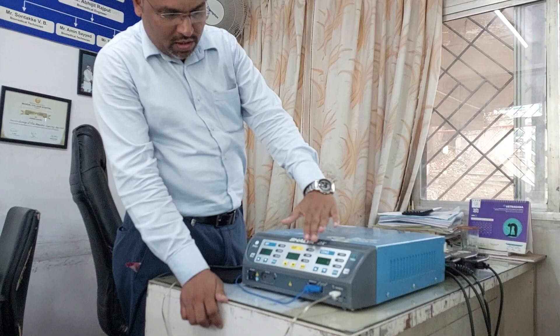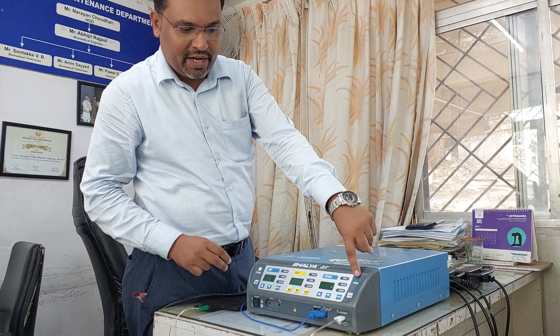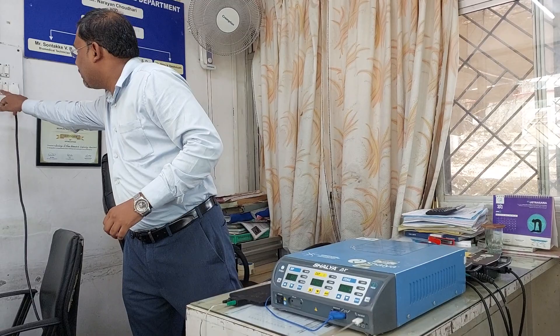There are different modes present on the cautery — bipolar, cutting, and coag. With the help of these arrows you can increase or decrease the settings. If the patient plate is not connected properly, you will get a red alarm, and the machine will not work until the patient plate is connected properly. Now I am going to switch on the cautery.